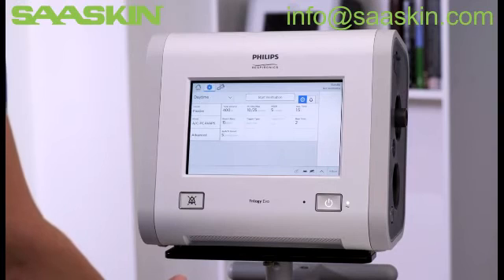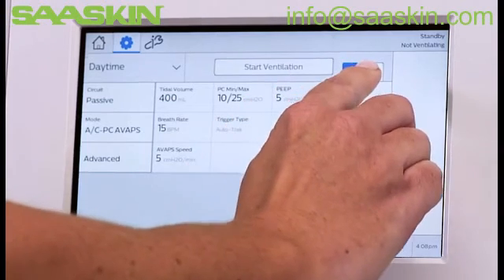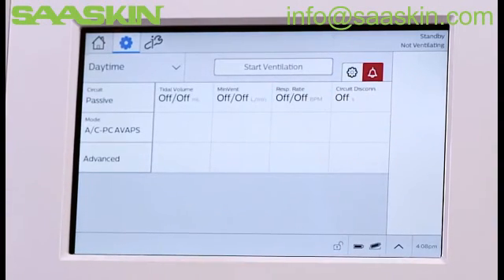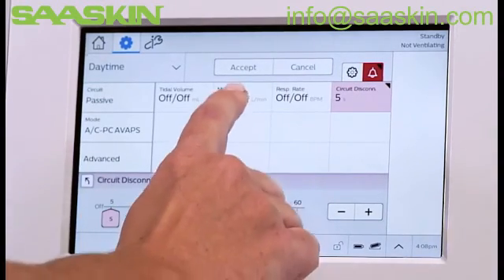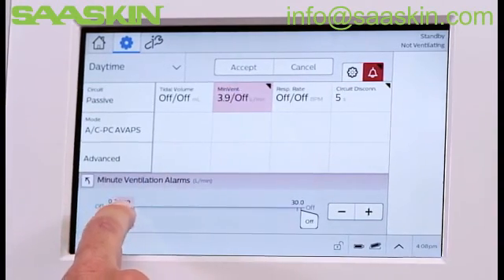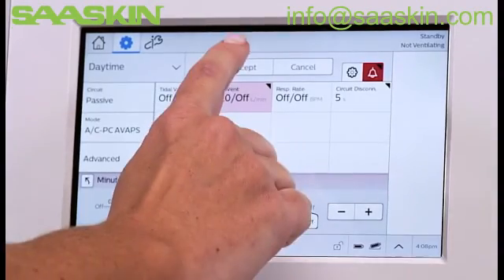To set the alarms, tap the alarm icon to view and edit applicable alarms. In this example, we're setting the circuit disconnect and low-minute ventilation alarm. As with the prescription settings, tap Accept for the alarm changes to save.